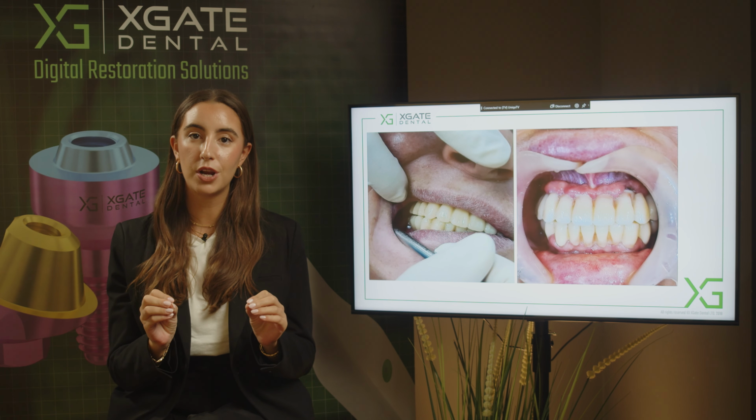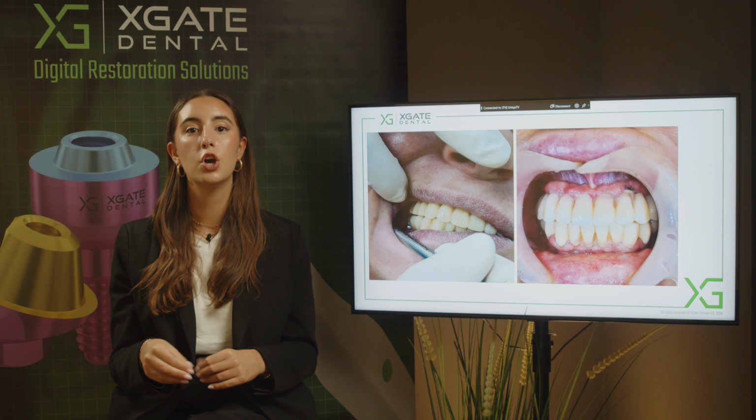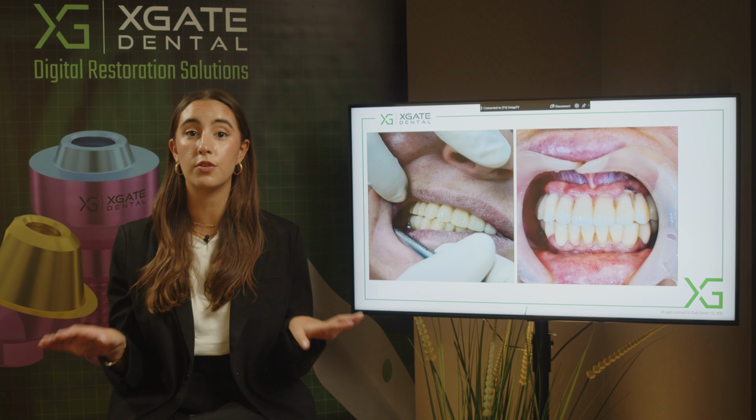But the first impression that we took with the first relations between the jaws and the vertical dimension, we could define it using this composite material in the first place. And we did it only once. You don't need to redo it.